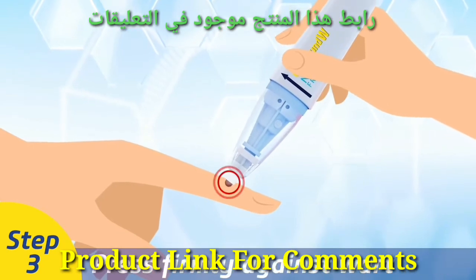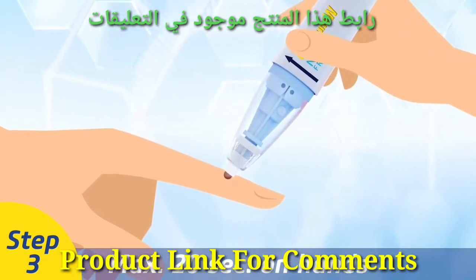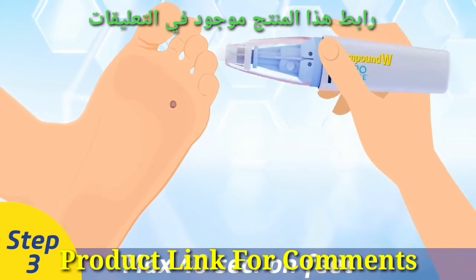Step 3. Immediately press the tip firmly against the wart and leave pressed for a maximum of 20 seconds on hands, fingers, or arms, and a maximum of 40 seconds for plantar warts on the bottom of feet.